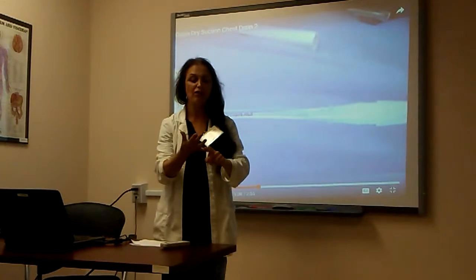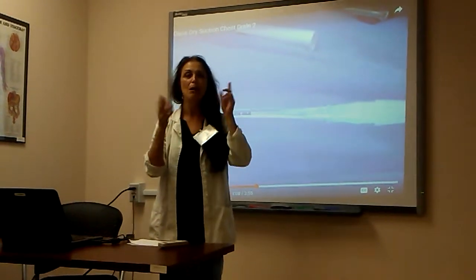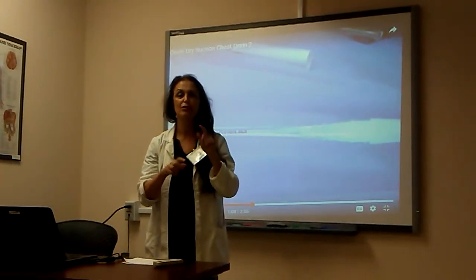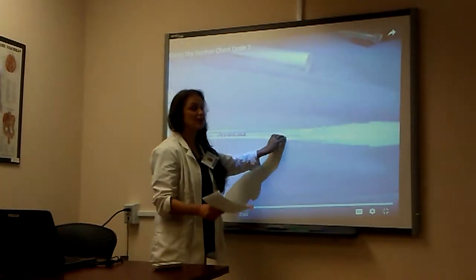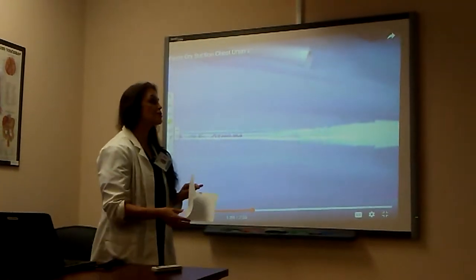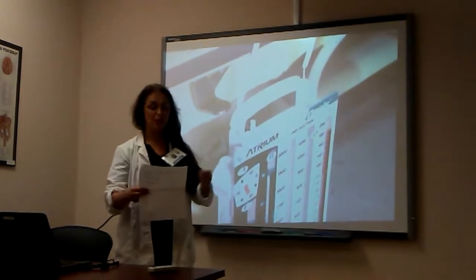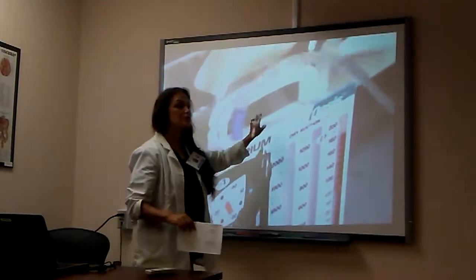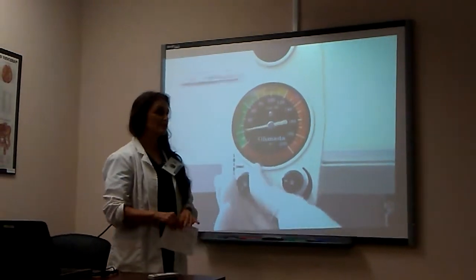Your role, get consent. Prep the area with iodine, make sure they have no allergies. Medicate the patient for pain. Be sure they have no allergies to caine drugs too, because the doctor will use lidocaine and he sutures the chest tube into place. The patients are usually presenting with shortness of breath. We talked about that already, accessory muscle use, and distended neck veins, also when you auscultate their lungs, you will hear dull or no sounds on the side that's collapsed.